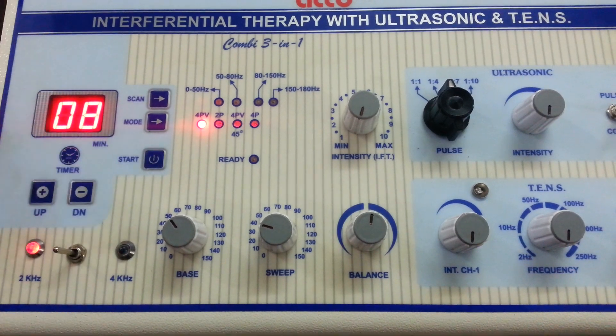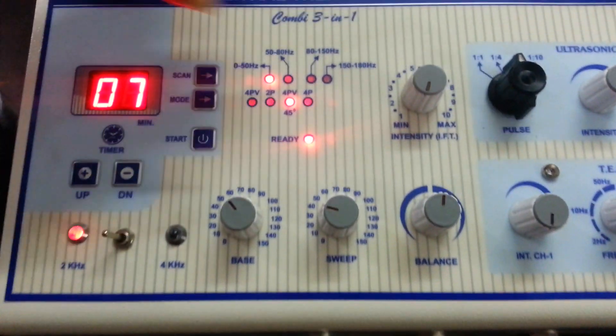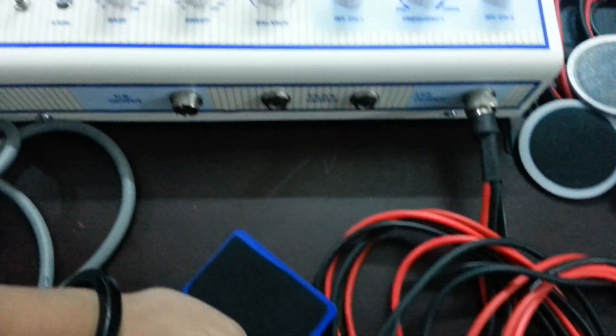Start the machine. Increase the intensity as per your need. After treatment is completed, make all the intensity knobs at zero.